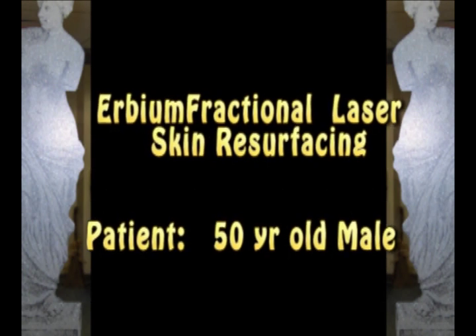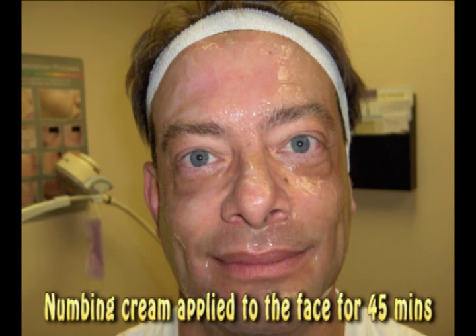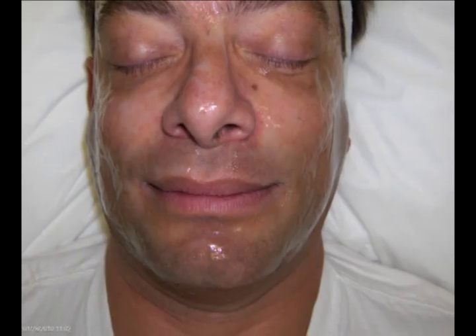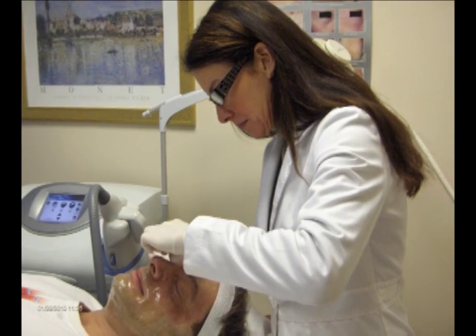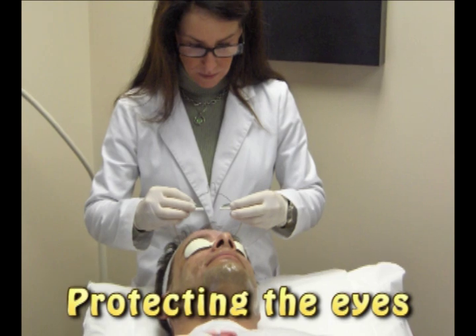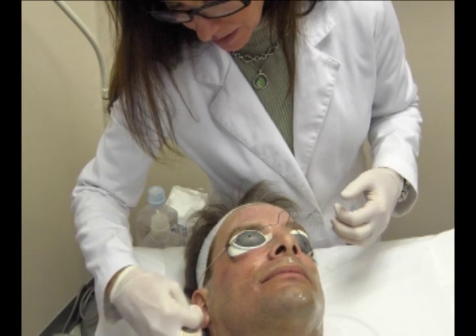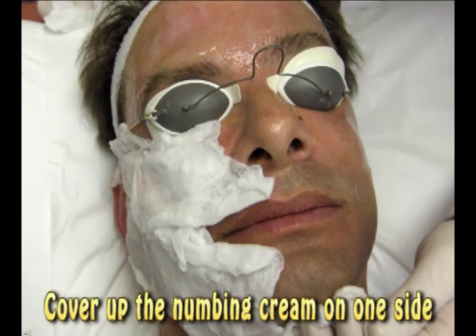This is what you've been asking for, and I'm going to give you what you need. We give you a topical numbing cream, let that sit on your face for about 45 minutes, and then we start our treatment, which takes about 45 minutes to an hour. Then you go home with a post-care kit that includes a cream you apply on your skin as needed to keep your skin nice and hydrated. Then you come back to the office in a week so we can see the progress.